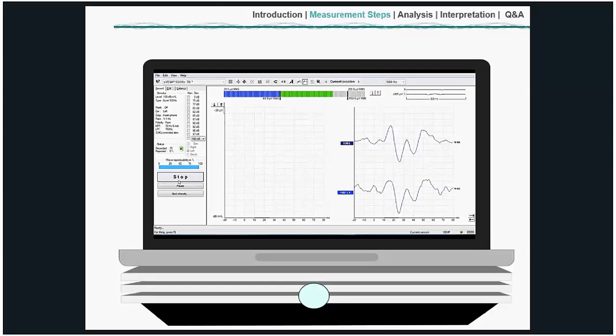And you notice that as soon as you start recording the response, you can see it very quickly on screen and it is very large, not like an ABR where we're always spending a long time actually recording it. So once we have two and we're happy that those are similar, then we can move over and test the right hand side. We can see this has changed to red now because we're on the right hand side, so the patient's looking to the left, contracting their muscles sufficiently.